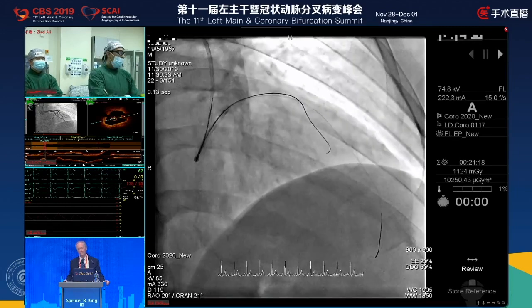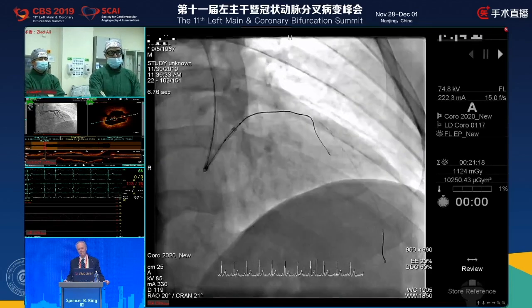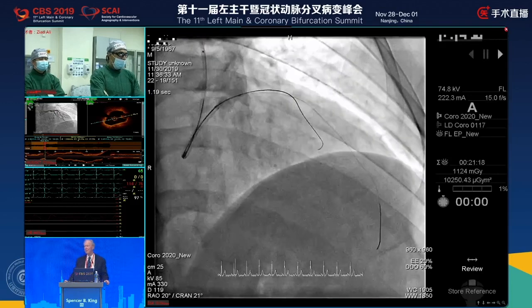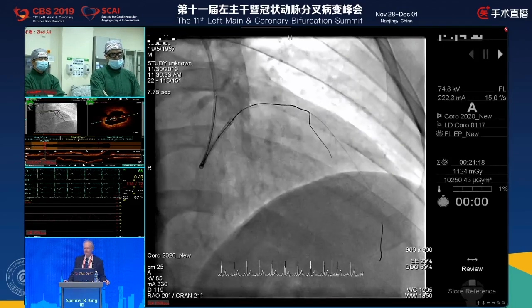We had a tough time getting into this. If we have a tough time dilating it, certainly we're not going to be rotablating into the septal. I think what we've done is opened up enough space. We've proved that by angiography and by invasive FFR that the main vessels, the diagonal, which was the question, as well as the LAD, aren't ischemic.